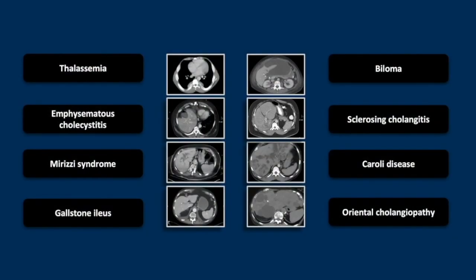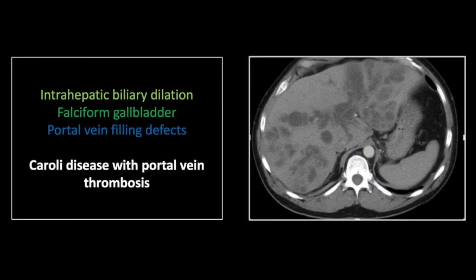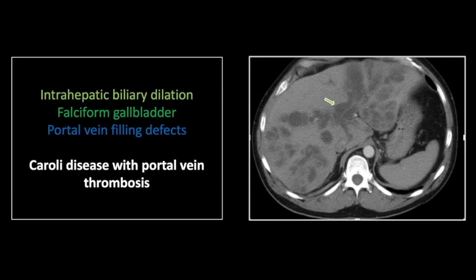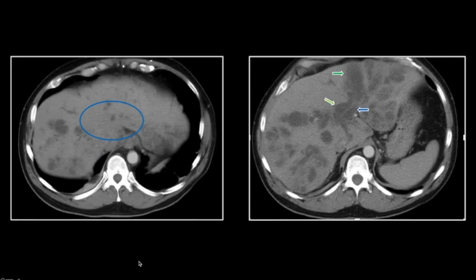Our next case is an unusual case of Caroli disease. There is extensive biliary dilation and even an unusual congenital malpositioning of the gallbladder here within the falciform fissure. In addition, however, there is extensive thrombosis of the entire portal venous system. That is a hard thing to appreciate on a single image, so we'll go to the video.